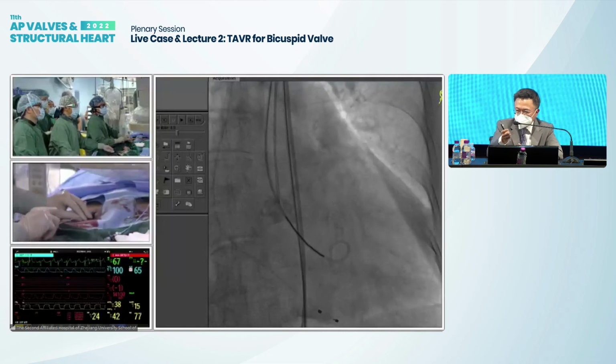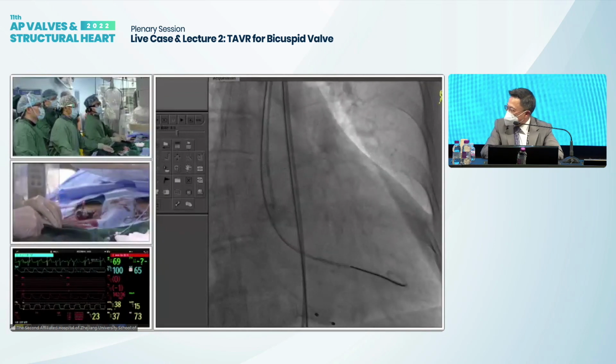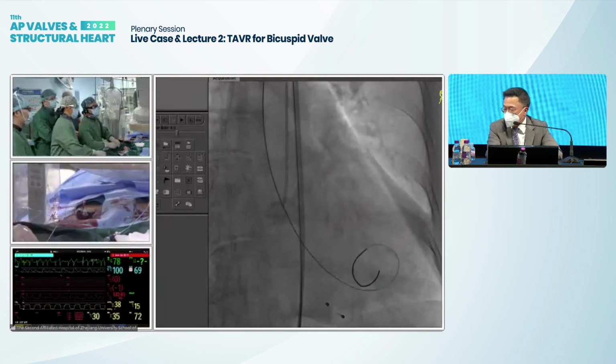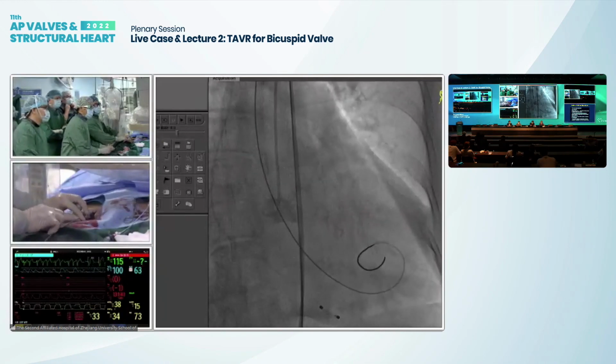Because if you leave a soft part, it just becomes a straight wire down. So I like to have it bent a bit and follow that curve. For example, try to bury it pretty deep in this picture and not hanging out high. So this is a better position.